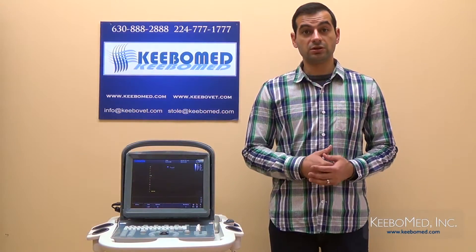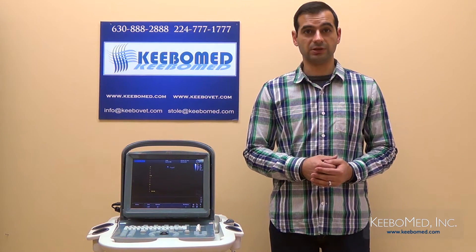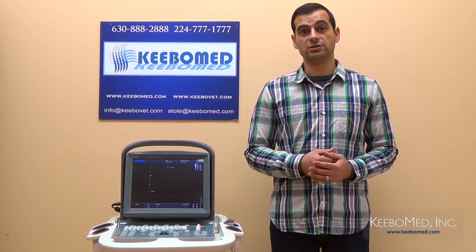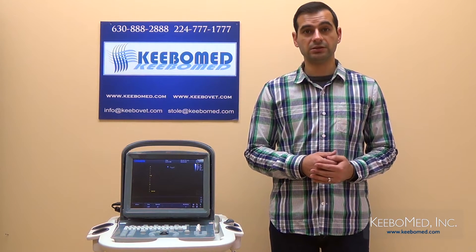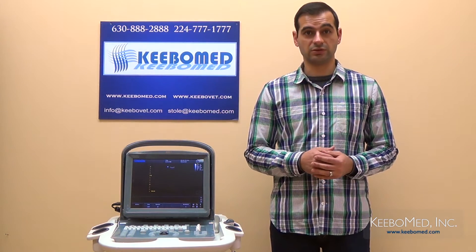The EcoOne Vet is good for both large and small animal examinations. Recommended large animal applications include reproduction and tendon exams. Applications recommended for small animals are abdomen, small parts, and even basic cardiology. So the EcoOne Vet can be very versatile for your veterinary practice.